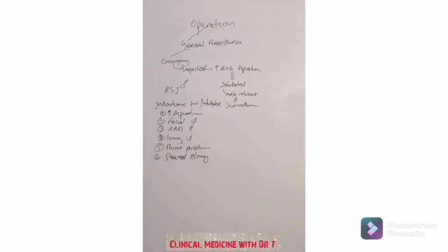So if the airway is going to be shared with the surgeons, whatever procedure needs to be done is going to be done in the airway, so that patient must be intubated. So these are the patients that need to be intubated.